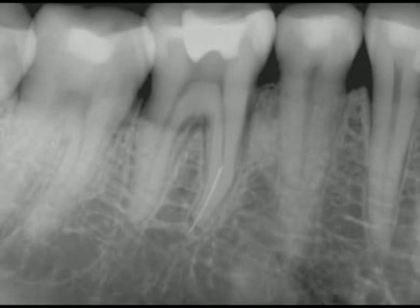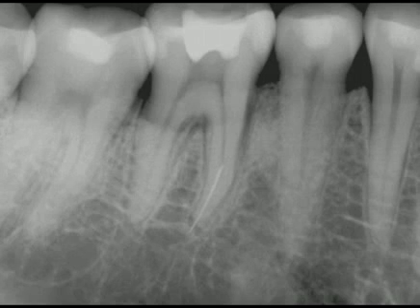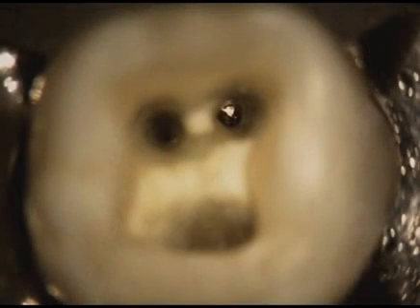In this preoperative film of a mandibular first molar, notice a broken instrument in the apical 1/3 of the mesial root. Notice the root is thin, and the angle between the file and the coronal 2/3 of the canal. A photograph shows straight line access and the head of the broken Naviflex file predictably lying on the outer wall.